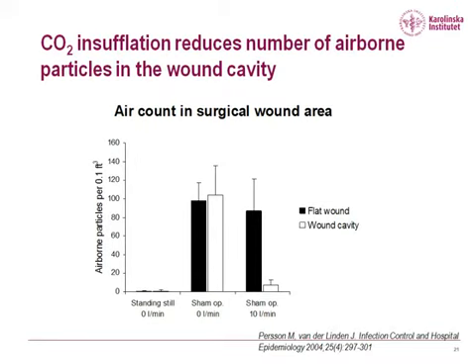There were no particles in the wound area. Whereas when they bent forward and performed the operation, or the sham operation, you had a high increase in airborne particles. And if you had a wound cavity and insufflated that wound cavity during this sham operation, you could decrease the number of particles in the wound area.